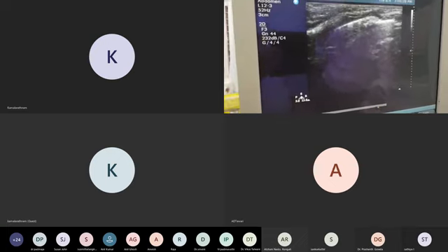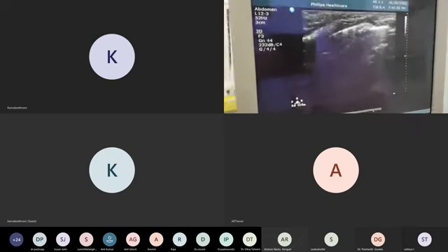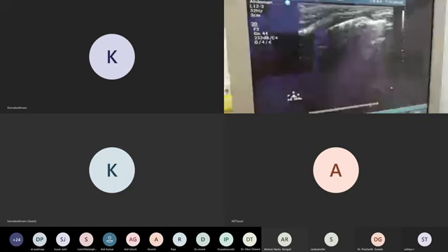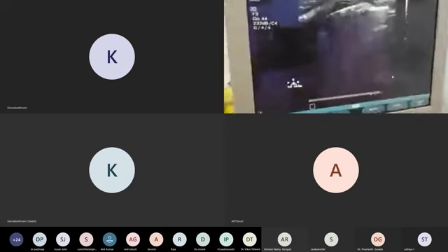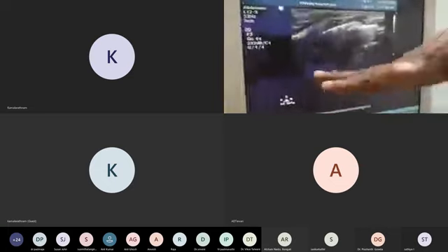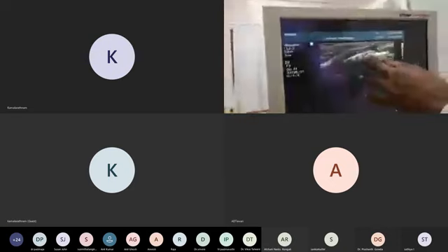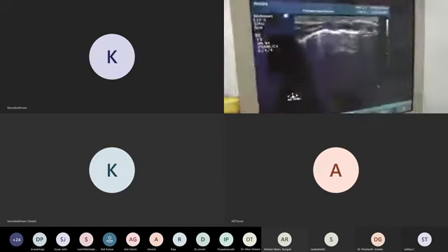What do you call it in English? Okay, mirage. That mirage, you know, if you come near, we'll feel like it is water, but it will be very glittery. That glittery word is called shimmering. It's like water. See my hand. It's like water moving and shining on the top. So shimmering line. That's what you can see here. Don't go with the English words and all, whatever words you know is more than enough.